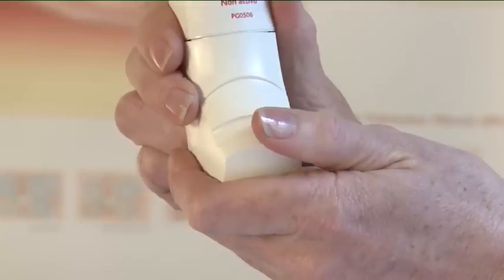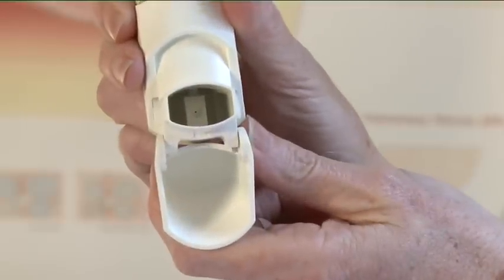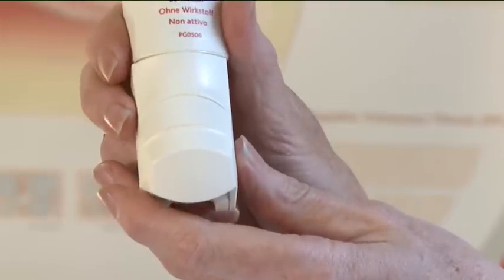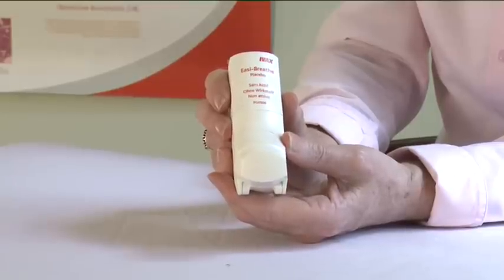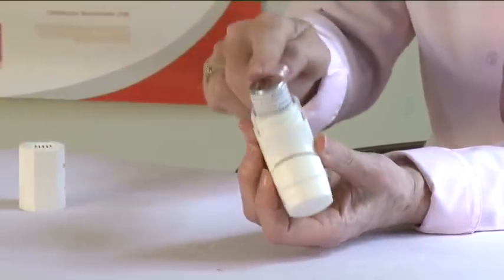Opening: To open the inhaler, pull down the cap which fits over the mouthpiece. Test spray the inhaler by firing two shots into the air before you use it for the first time, and also if you have not used it for a period of five days or more. To test spray your inhaler, unscrew the top of it so you can see a metal can inside.